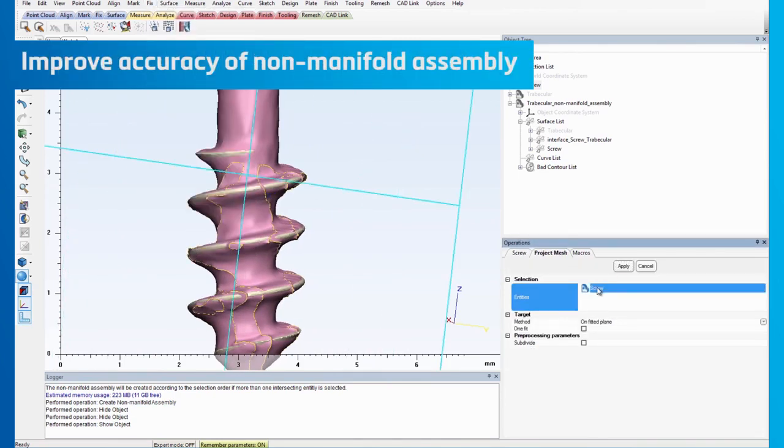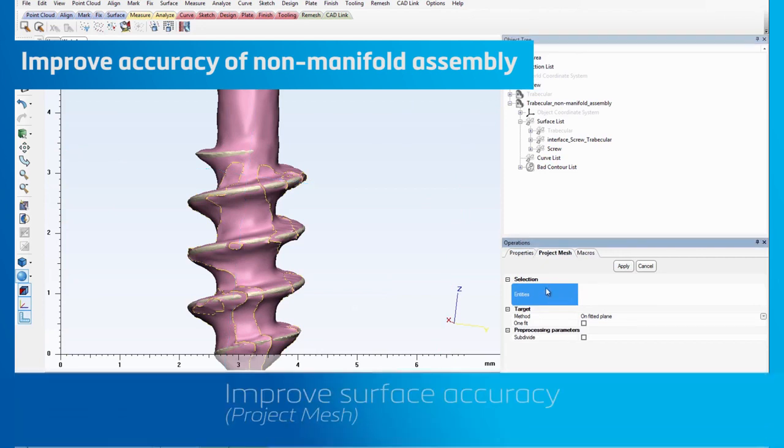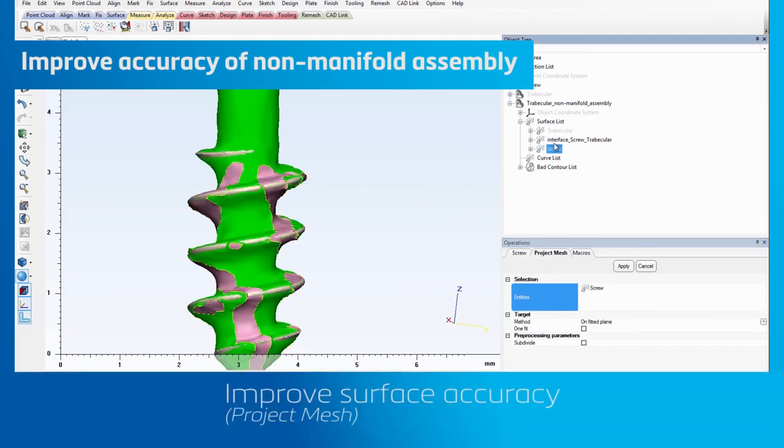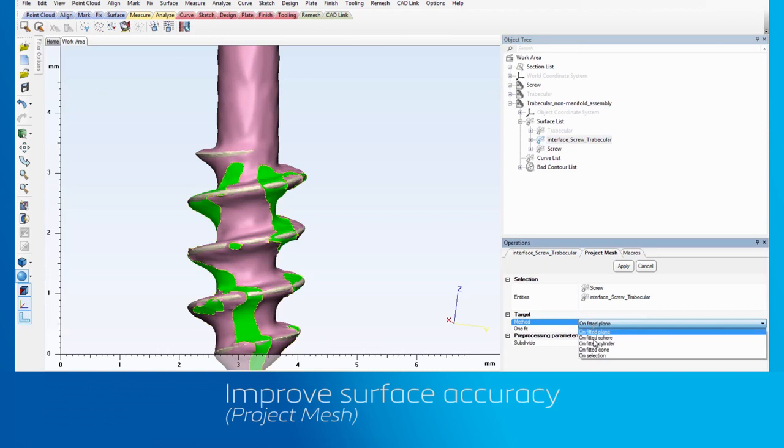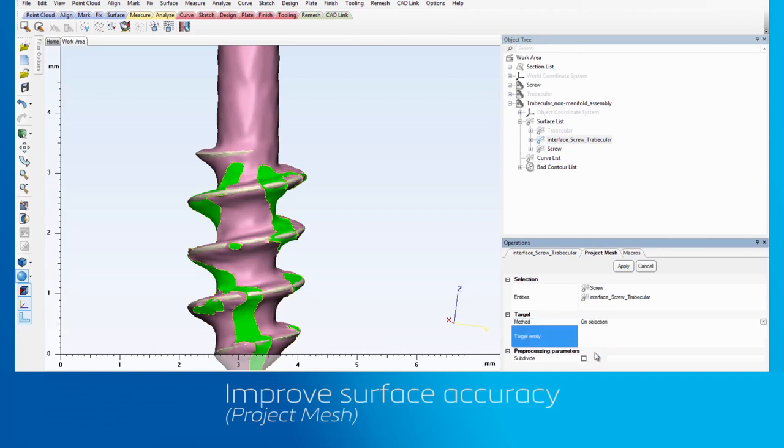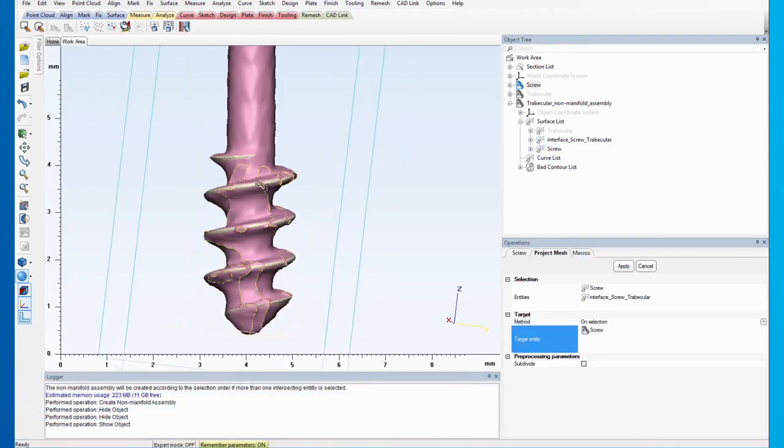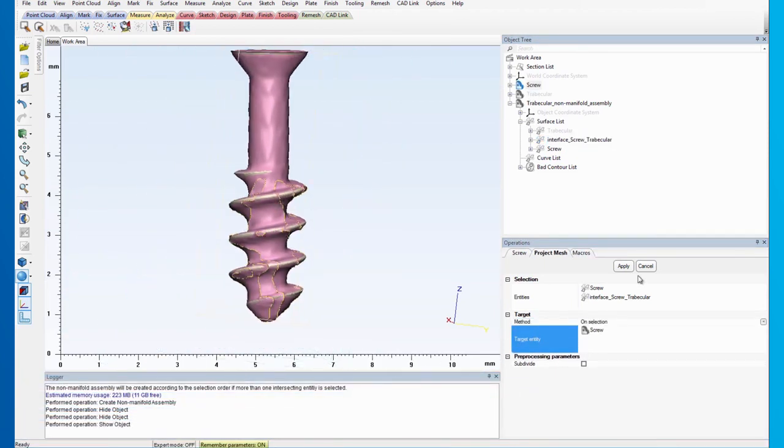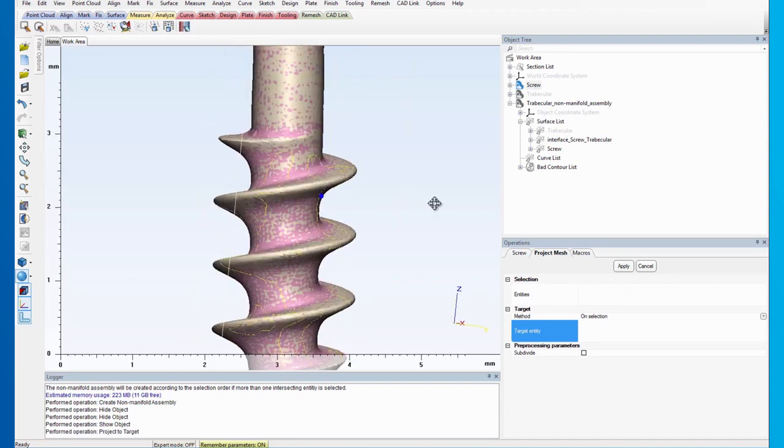We can achieve this by using the Project Mesh operation in the Fix menu. We will then project the meshes of the interface and screw surface sets to the original screw part. The result is a noticeably more accurate screw.